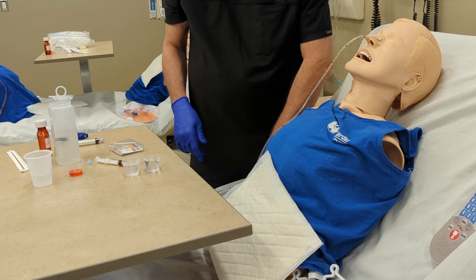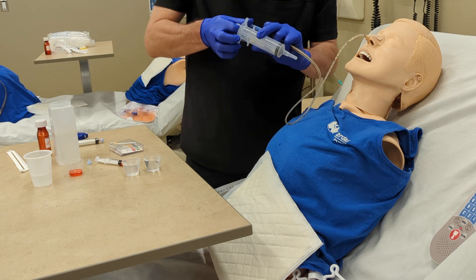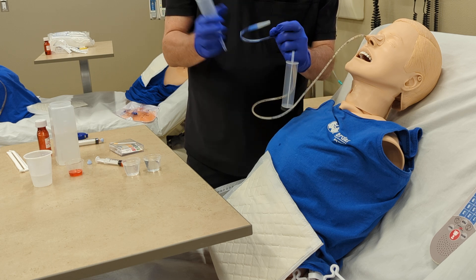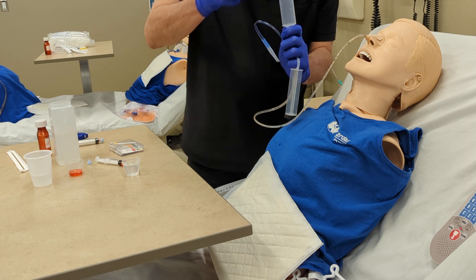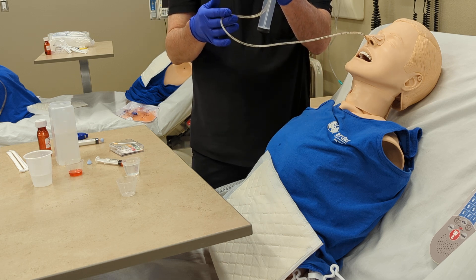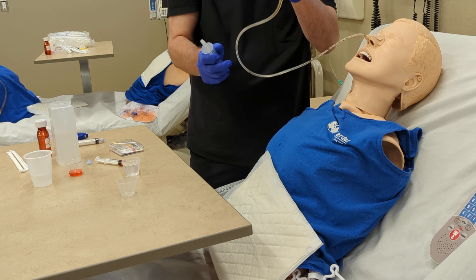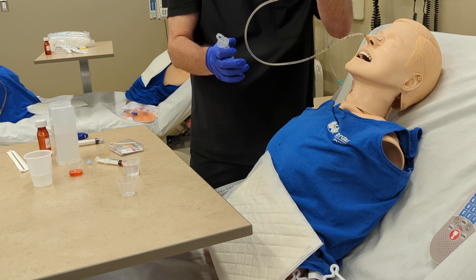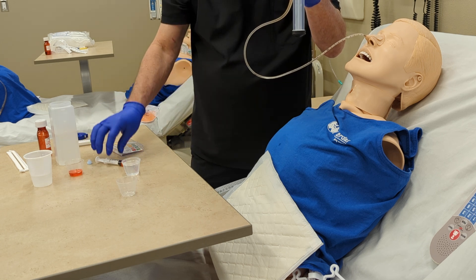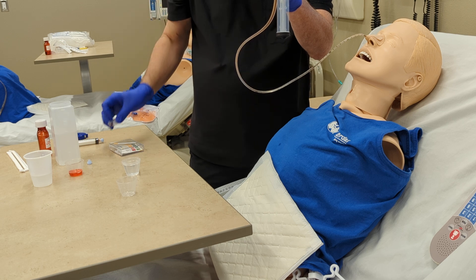Now I'm going to get ready to administer the medication. I get the syringe, open it up, and use my little pinky as the holder. I'm going to put the NG in here, flush it with water, and with gravity I'm going to try and lift it up. If it starts to flow, we're good; if it doesn't flow, I'm going to give it a little bit of a boost — and normally that boost will help start it flowing. It's now flowing. I'm going to hold it with my pinky, get my two cc's of medication, and put it right there on top.